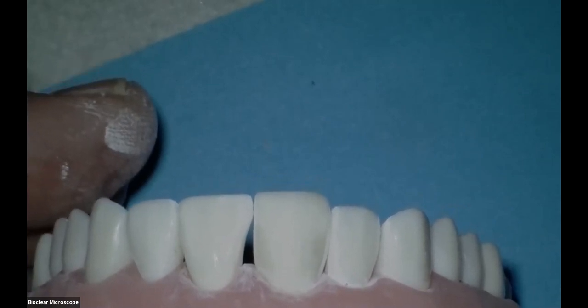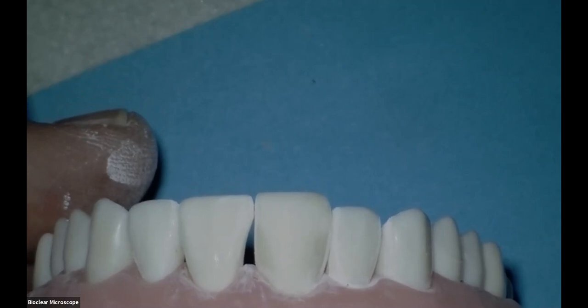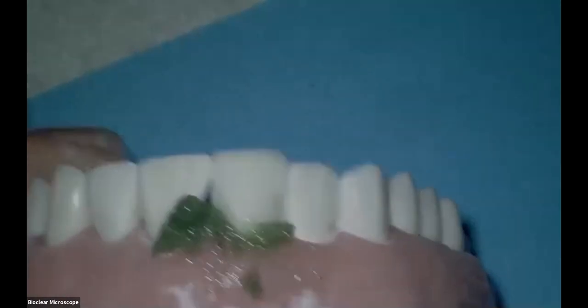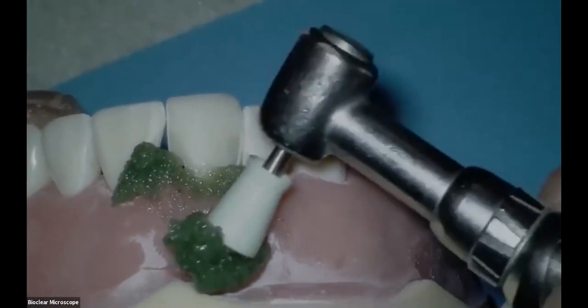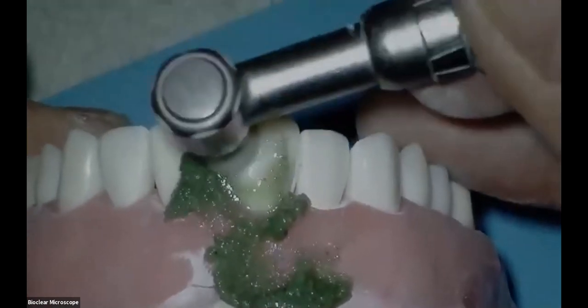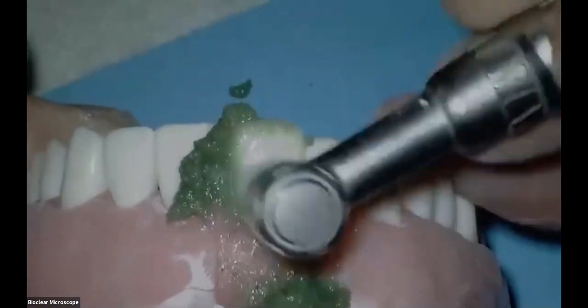Okay. So the Rockstar polish is a two-step. This is the magic mix. And so we put some up here on the vestibule. There you go. Thank you, Tanya. This is what comes with the system. So we're going to go ahead and get a disposable cup, run this at about medium speed, getting fresh magic mix every few seconds.